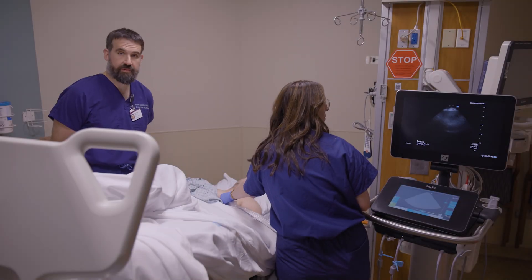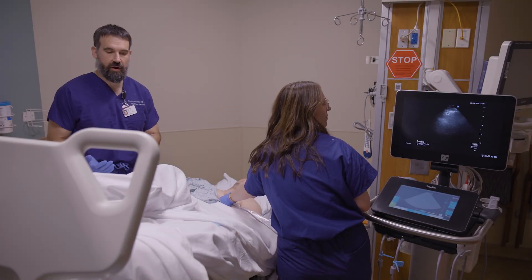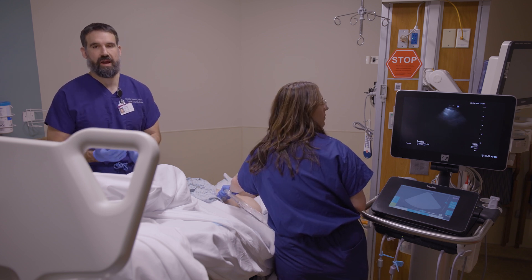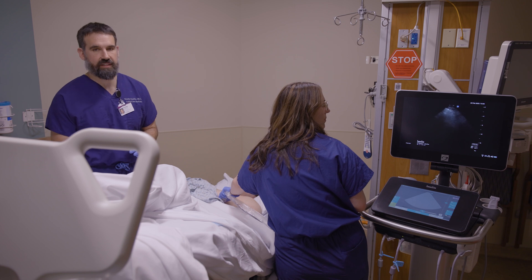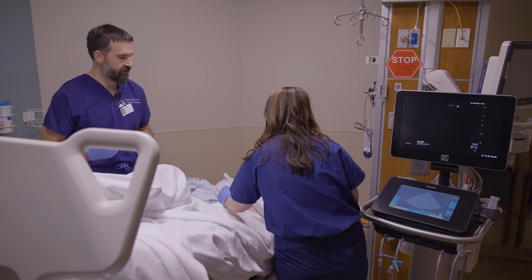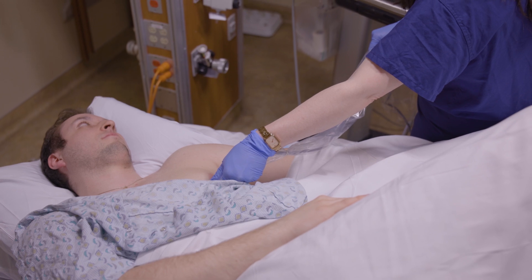The patient has been repositioned approximately 30 degrees legs up. It's really important that you use some sort of passive process to raise the legs rather than actively lifting them, because that can cause pain to the patient and skew the results. Now Lauren is going to repeat the process.